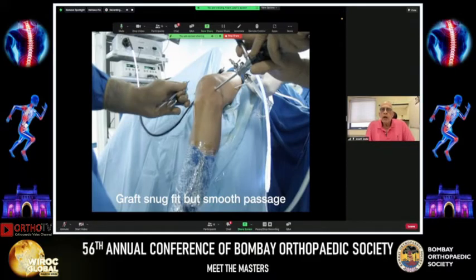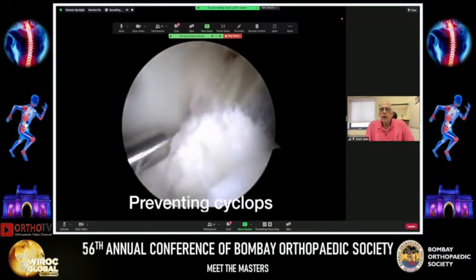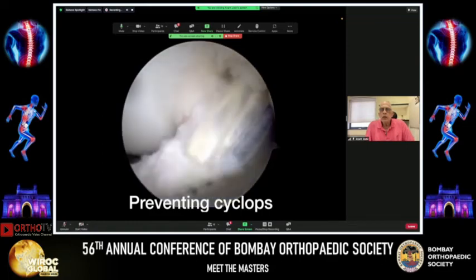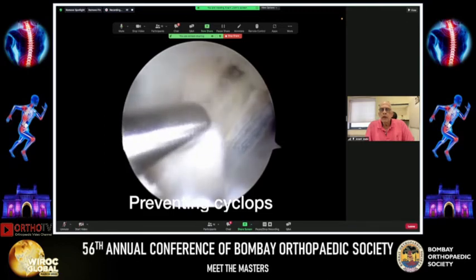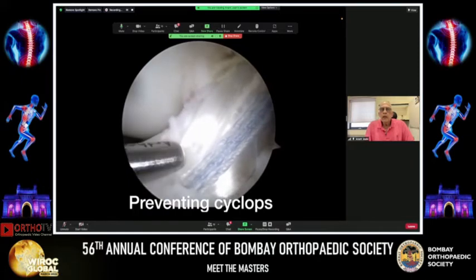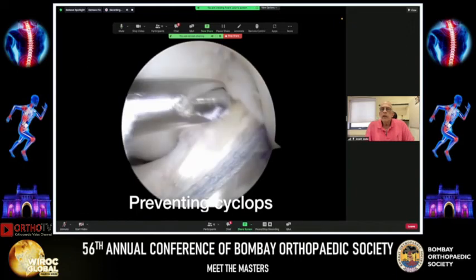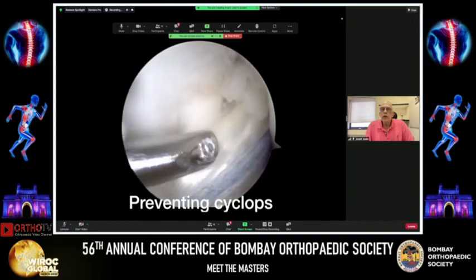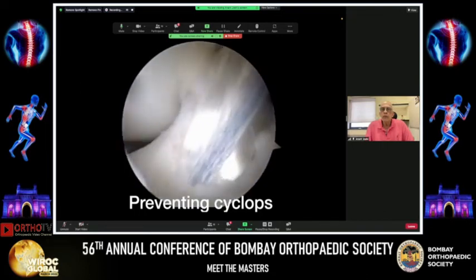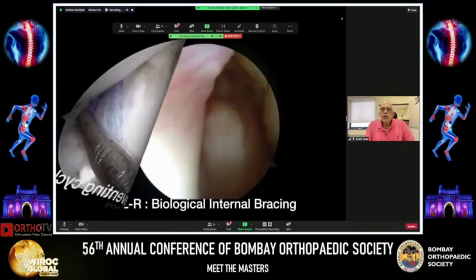After passing the graft, take a relook into the knee to ensure there is no debris anterior to the ACL graft, as this can lead to a cyclops lesion, graft impingement, and restricted knee extension. Clean up anything anterior to the ACL graft using a small joint shaver to avoid damaging the graft. Extend and flex the knee to confirm there is no graft impingement before fixing the graft on the tibial side.